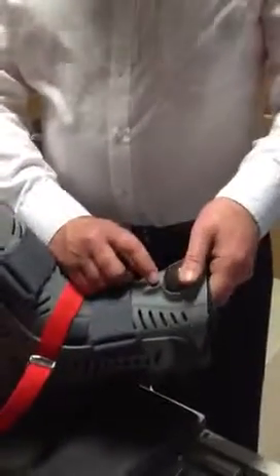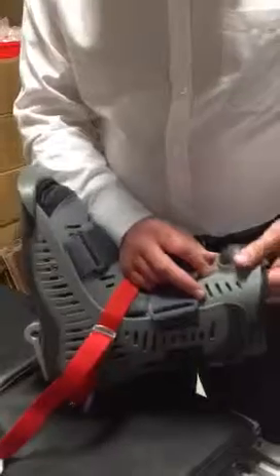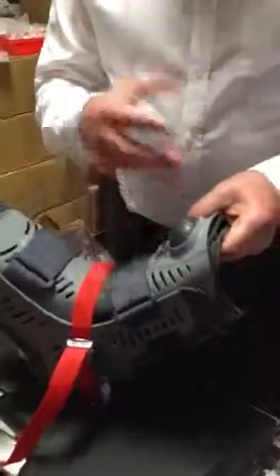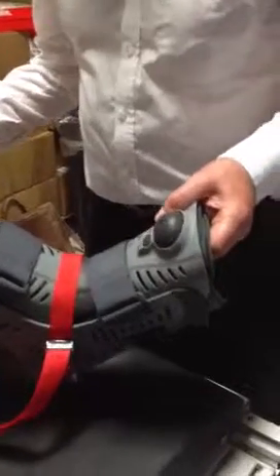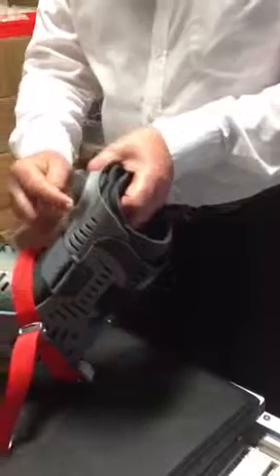And that's the deflation. That's one of the reasons we chose this boot over any of the others. All the others we found, the inflator was separate from the boot. So guess what? It's never there. So the inflator's all right there? That's it. You pump that to inflate, and you press that to deflate.